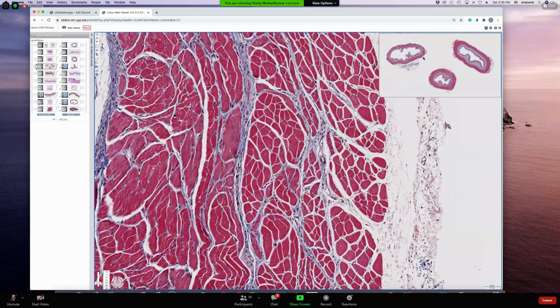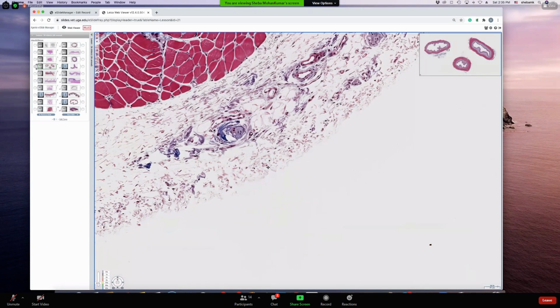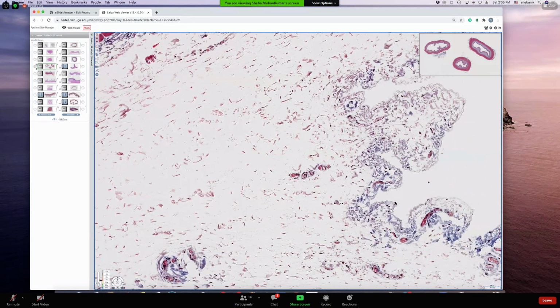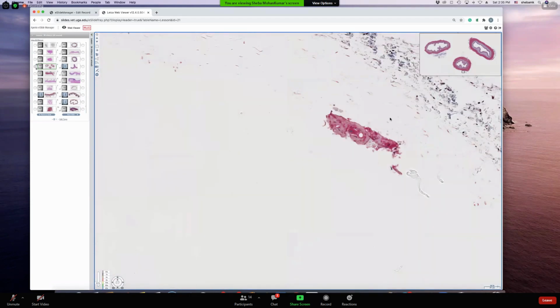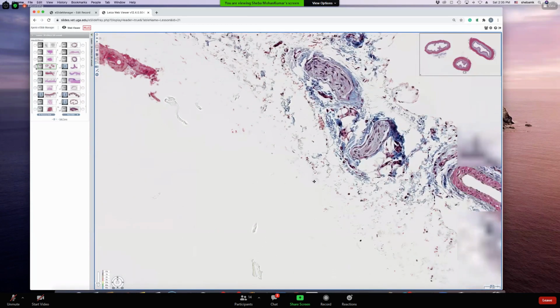Depending on whether there is a mesothelial covering on the surface or not, you can determine whether it is serosa. Like here, there is mesothelium covering it, so this would be serosa. But here it's kind of torn. Can you see it? There is no clear covering.